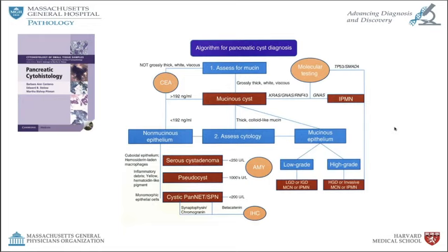I'll ask you one last question. Some of our participants are wondering, what would be the difference between cytospin versus thin prep? You said you don't use thin prep that often. Do you recommend one over another? And what would be the morphologic difference that you would see on these cases?